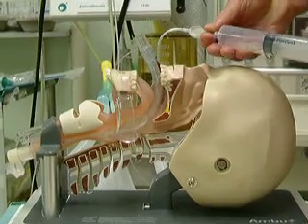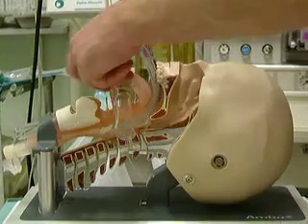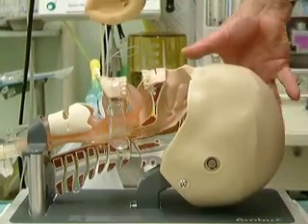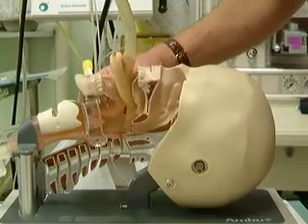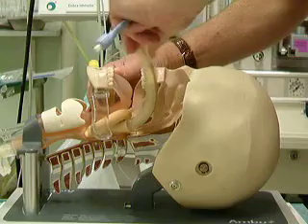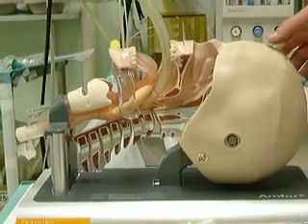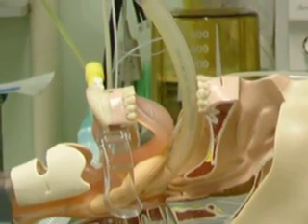Putting airways into the mannequin isn't easy, but it gives a demonstration here of how it sits. If I compare it to a size 4 laryngeal mask, you can see that it really is what I call a periglottic airway, tenting the esophagus and sitting over the laryngeal inlet.